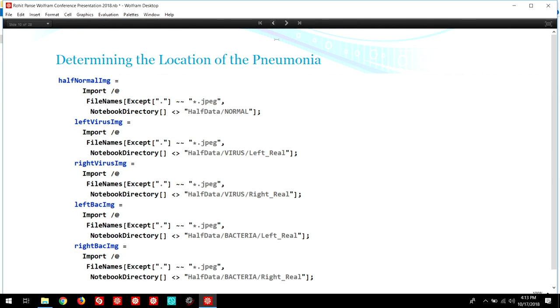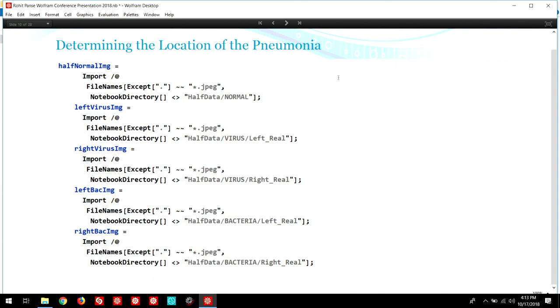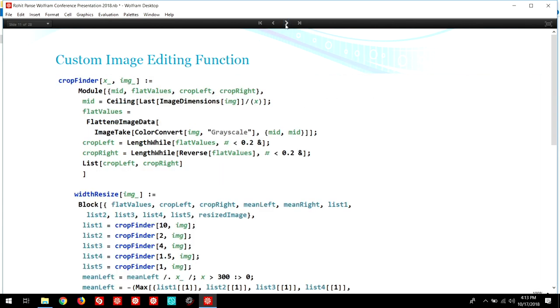For the pneumonia location detection part of this project, a subset of the data was created. 100 images of the left lobe normal and the right lobe normal each, and 100 images of the left lobe virus, right lobe virus, left lobe bacteria, right lobe bacteria pneumonia each were selected to train four separate neural networks to help determine the location of the pneumonia. Here are the statements I used to import the unedited chest x-rays. Here are the functions which were used to edit the images: width resize and crop resize, crop finder.